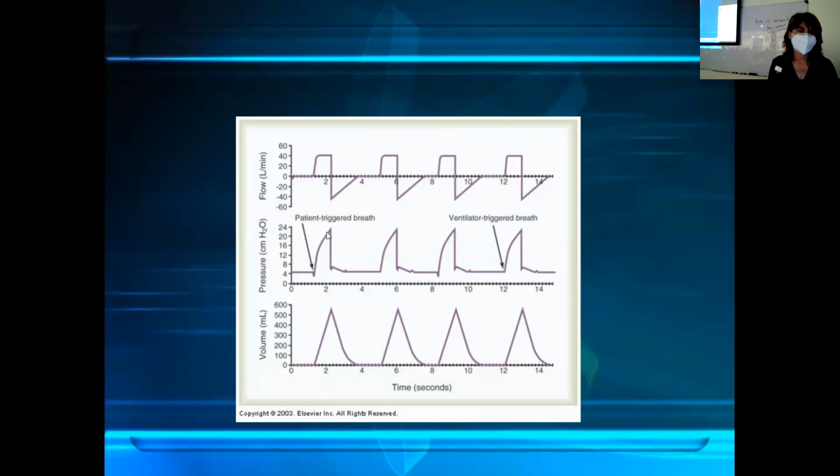So inspiration all the way up to the peak, exhalation after the peak. What's that little bump right after, is that something we don't really pay attention to? Correct. Do you have to pay attention to this? No. Or the little one after that? Oh, this one? Just looks like. No, not for now.